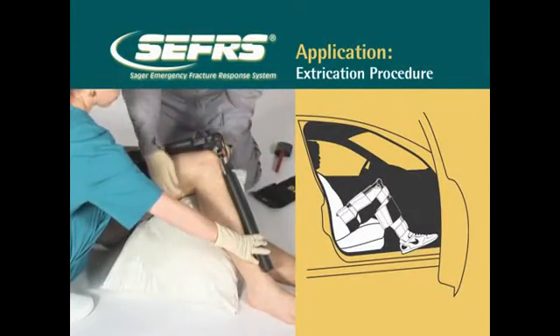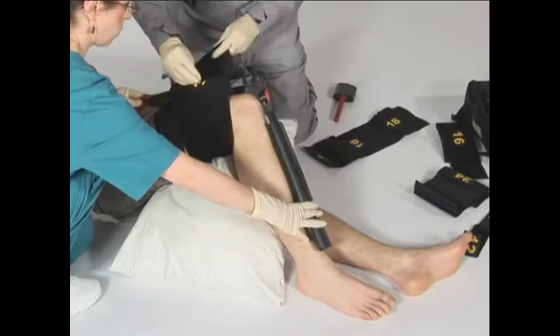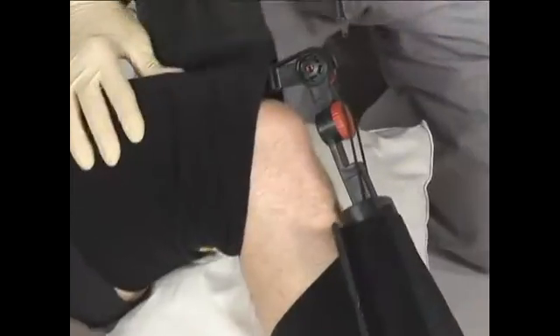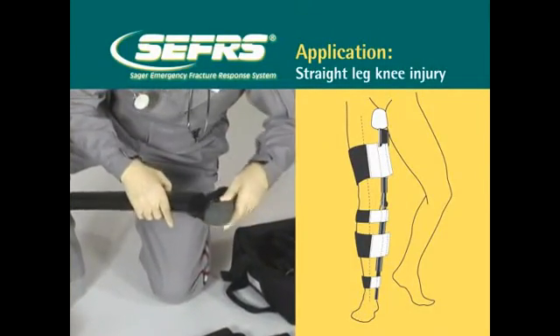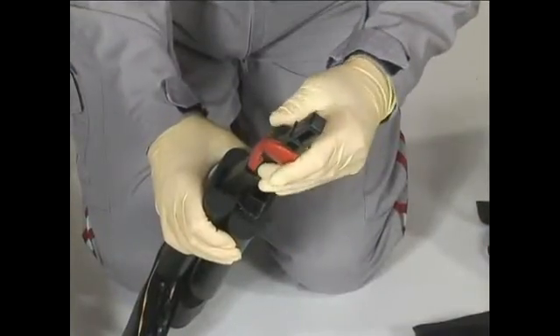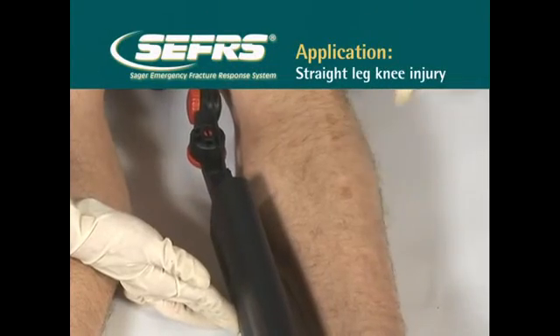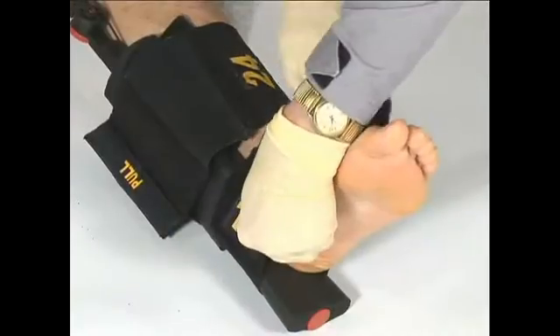After clearing the obstruction with the jaws of life, position the splint in preparation for extraction, splinting the limb in position found. Place tensor cravats as needed for stability. If the ankle or limb is still unstable, SAM splints can be used in conjunction with Sager's figure 8 straps for additional immobilization and support. When splinting with Sager's, create a 6 to 10 degree valgus on the distal half of the splint and lock the device in place. This ensures that no stress or force is placed on the peroneal nerve, located around the base of the fibular head. Make sure that the cravat is added distal to the head of the fibula to avoid compression of the peroneal nerve.